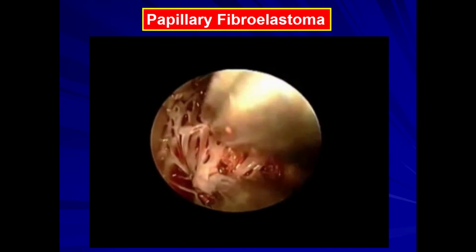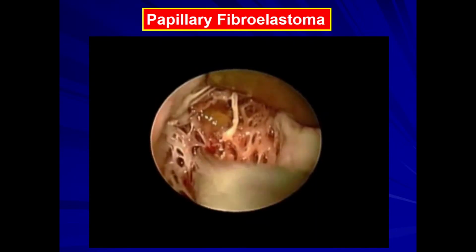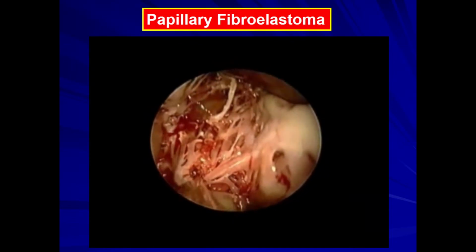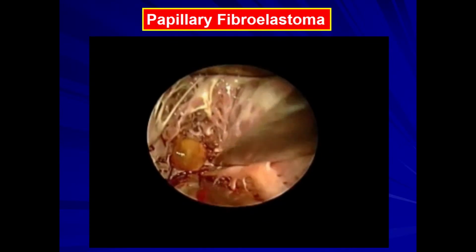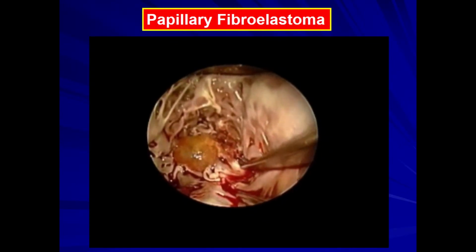And the rest of this video is literally just the surgeon cutting through all this trabeculae to actually extract this mass from the LV apex. And there it is. So it's going to pop out in just a second.